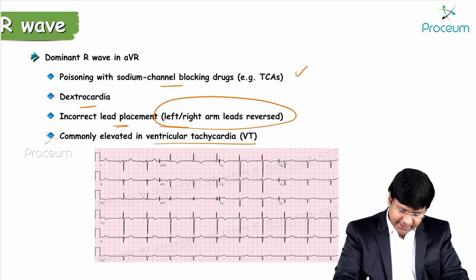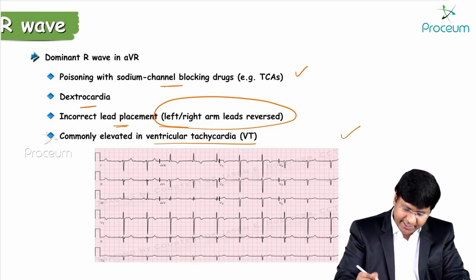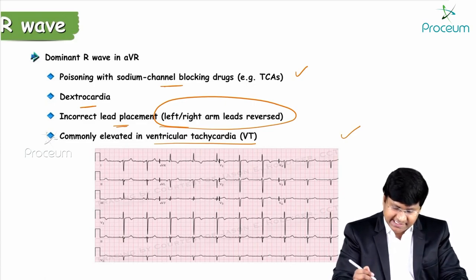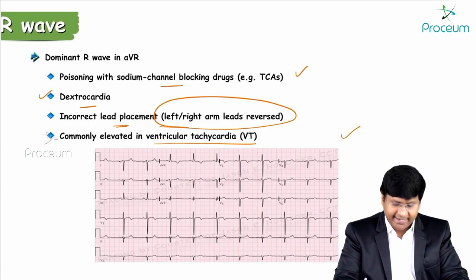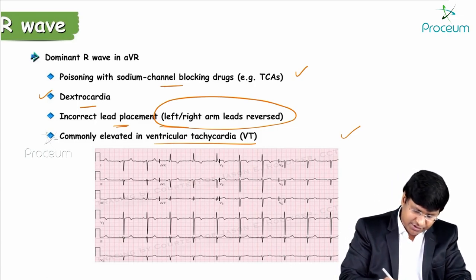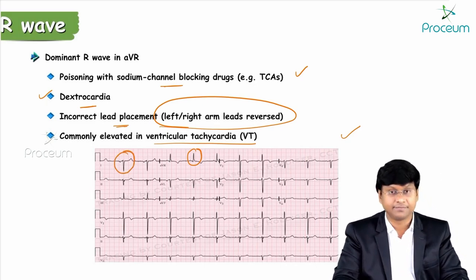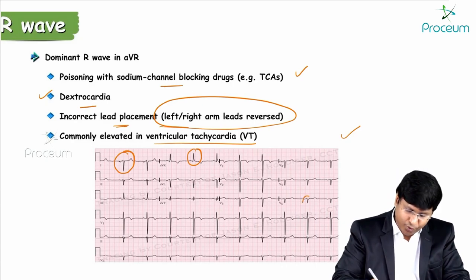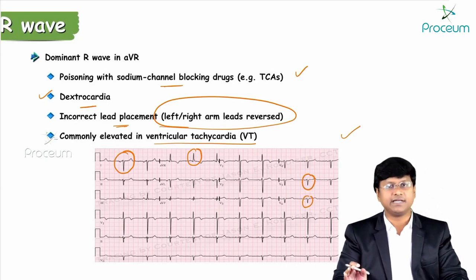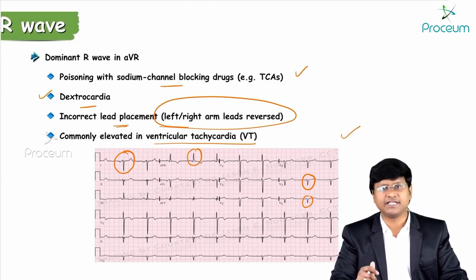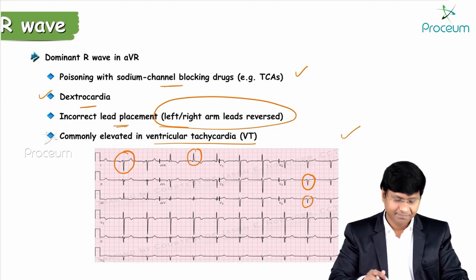ECG shown: dominant R wave in AVR, global negativity of lead I, and poor R wave progression in the precordial leads. This is the ECG of dextrocardia, fulfilling all the criteria: right axis deviation, positive QRS in AVR, global negativity in lead I, and absent R wave progression.